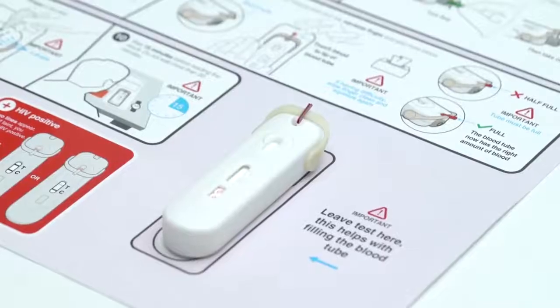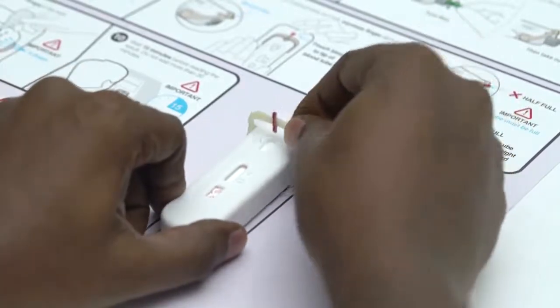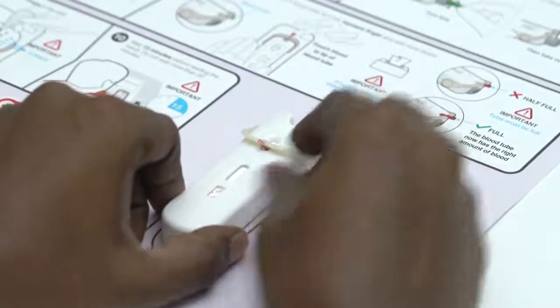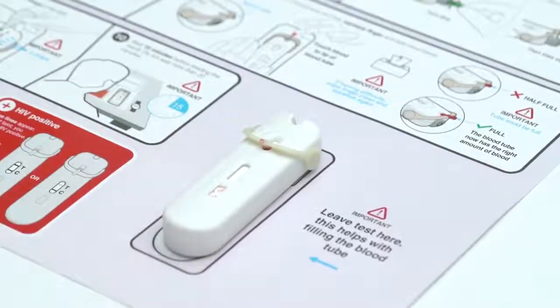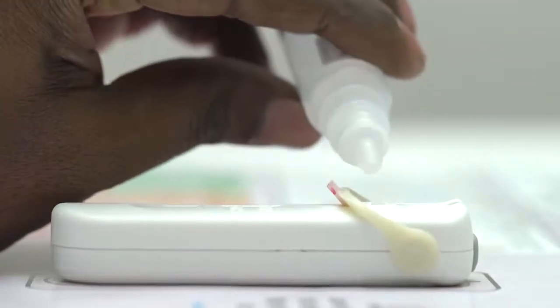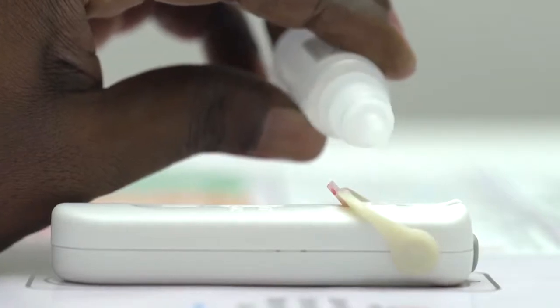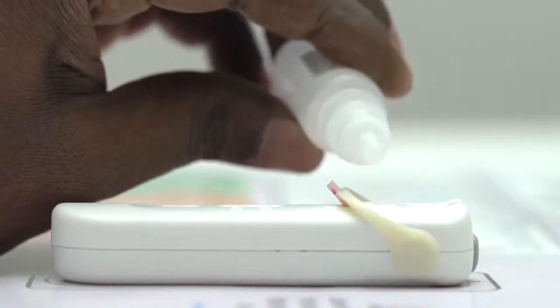Hold the test on the table and flip the tube over using its support arm until it stops. Check to make sure the blood has moved from the tube into the well. Now add 4 drops of test fluid into the well on top of the blood: 1, 2, 3, 4.